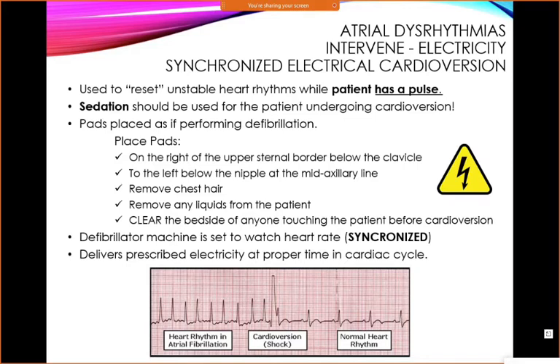But it is synchronized, so it reads the cycle. It reads it and then sends out the shock at the right spot. And then it's basically electronically resetting the heart. So both of these, the adenosine and the synchronized cardioversion, are ways for us to just stop the heart briefly and let it reset. So you can see this patient here has a heart rhythm that was super, super fast.